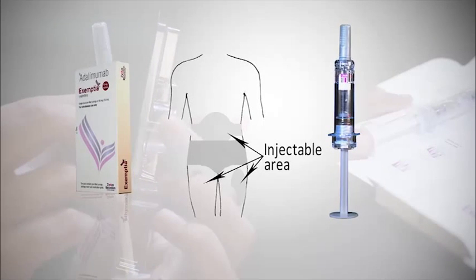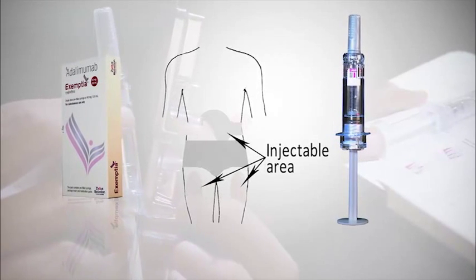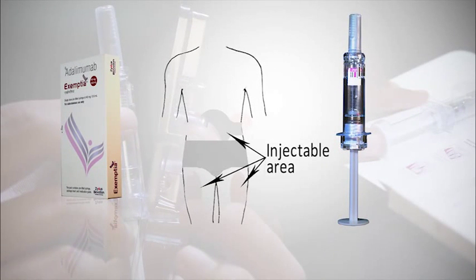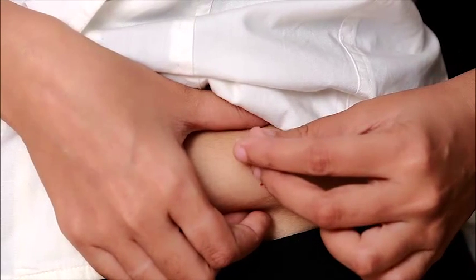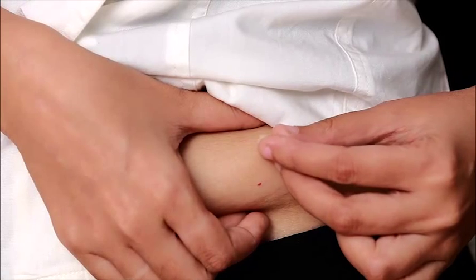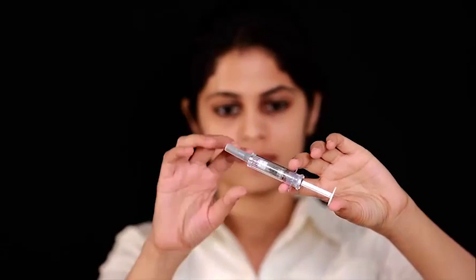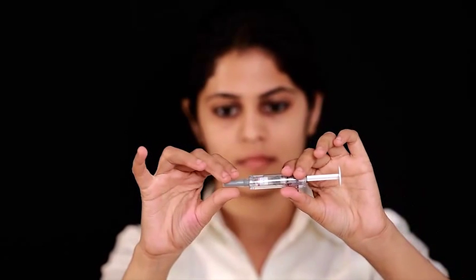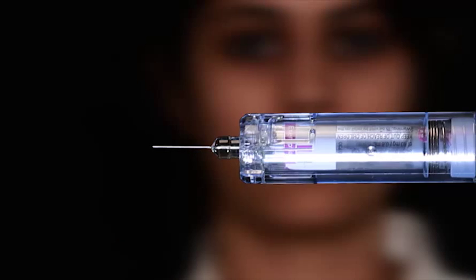This PFS can be injected in the front portion of the thigh or the lower abdomen. To begin, wipe the injection site with an alcohol swab using a circular motion. Hold the syringe in one hand and with the other, remove the needle cover and throw it away. Turn the syringe so the needle faces upwards.